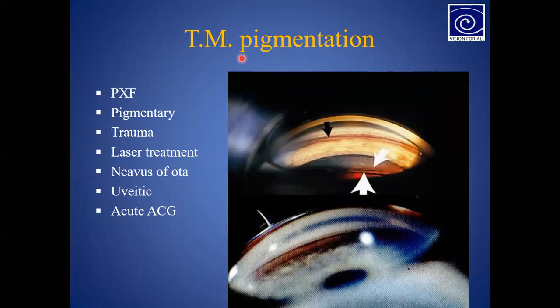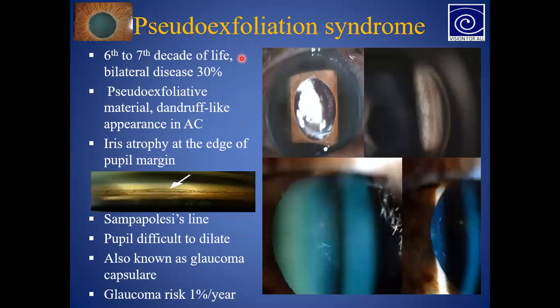That can be related to something known as pigment dispersion syndrome. So अगर trabecular meshwork का pigmentation ज़्यादा हो रहा है, then that will be suspected as pigment dispersion syndrome, and the angle structure is abnormal because of this only, and also in pigment dispersion syndrome the patient's IOP will be high.